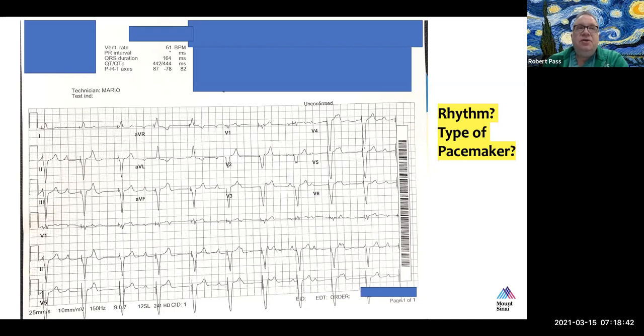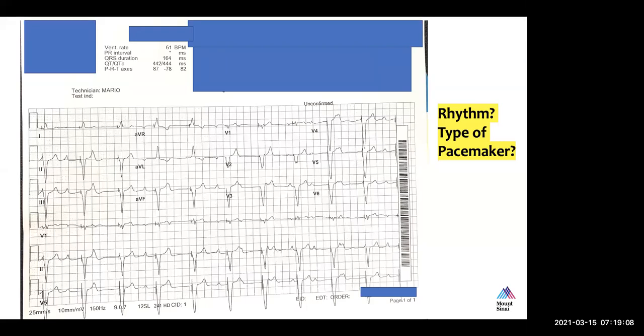What would be another reason you would consider putting in a dual chamber pacemaker and getting AV synchrony? What other feature of cardiac performance could be enhanced by having a dual chamber pacemaker versus an asynchronous VVI pacemaker? Better longevity, because if it is sensing and then pacing, that would be better than always just pacing.